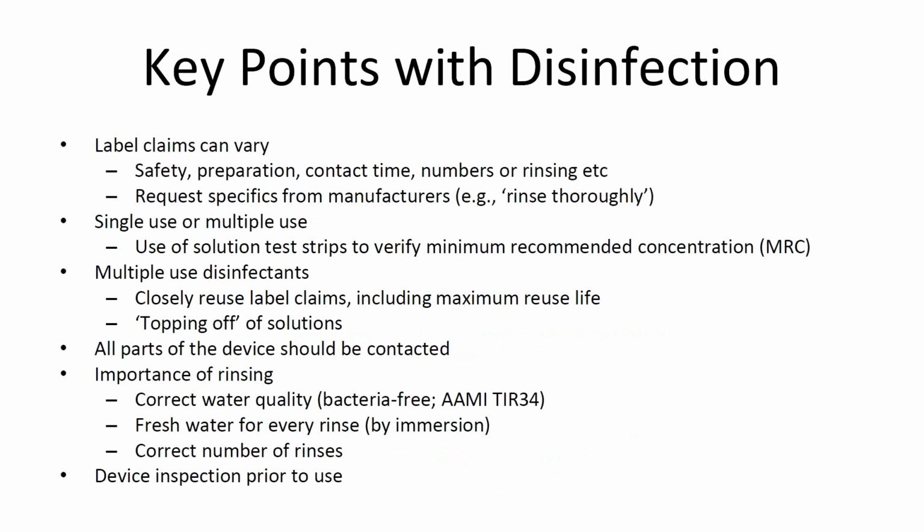We know that label claims of disinfectants can vary. So there could be different numbers of rinsing that need to be performed after soaking the endoscope. They vary in their contact times from very short periods of time up through 45 minutes. So we want to make sure that we are using our disinfectant according to its label claims. So you need to refer to the label of the disinfectant for that information.